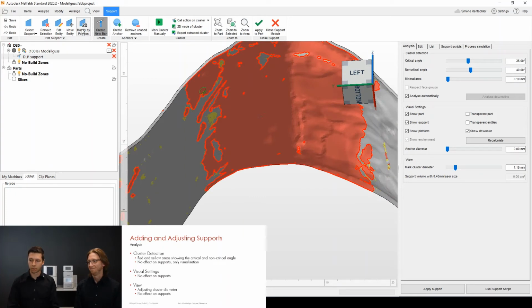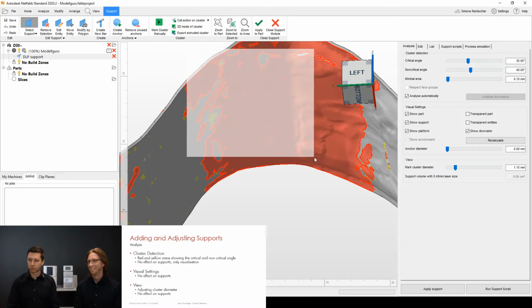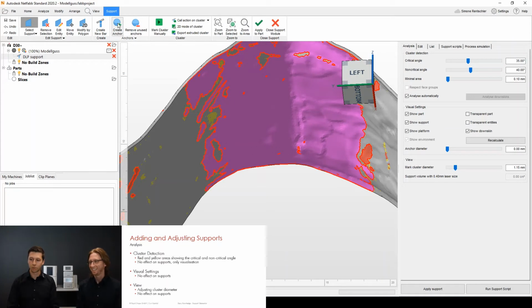Okay, Robert will tell you later on how it is going. So I will just create an anchor here. You can't see anything because it's set on 0. If I set the anchor diameter higher, I can see, oh, there's a blue bubble now. So this won't be printed at all. This is just visualization again. And an anchor is just a start and ending point of one support. So we will show you how to create supports later.